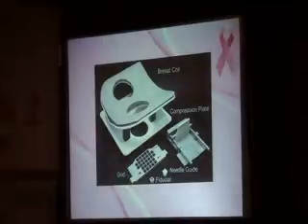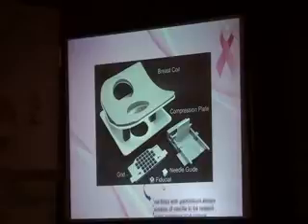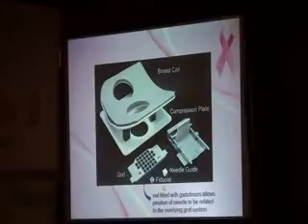These are the equipment that are used during the biopsy. This is the breast coil in which the breast is placed. The compression plate, the grid, the needle guide, and the fiducial marker all help to localize the lesion. A fiducial marker is usually a vial filled with gadolinium or vitamin E marker that can help us localize the lesion. And this is what it looks like when it's fully assembled.